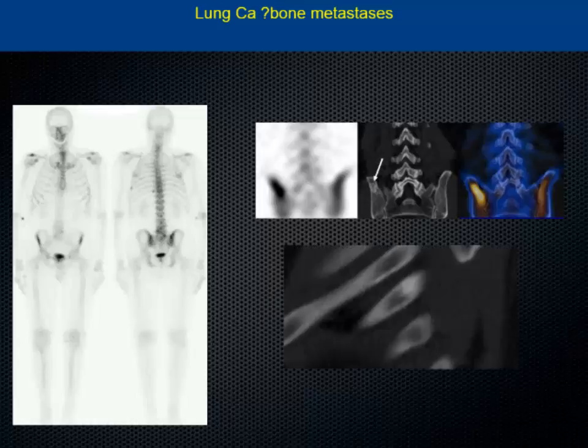And then we do a SPECT CT around this area, there is again sclerosis here. But the same sclerosis, in absence of this lesion, you can underplay it, saying it could be just post-traumatic or a healing fracture or something like that. But you see an extra lesion which is sclerosed, and that is definitely bone metastasis, then you upstage, there are two sites of metastasis. What was equivocal becomes a definitive diagnosis.